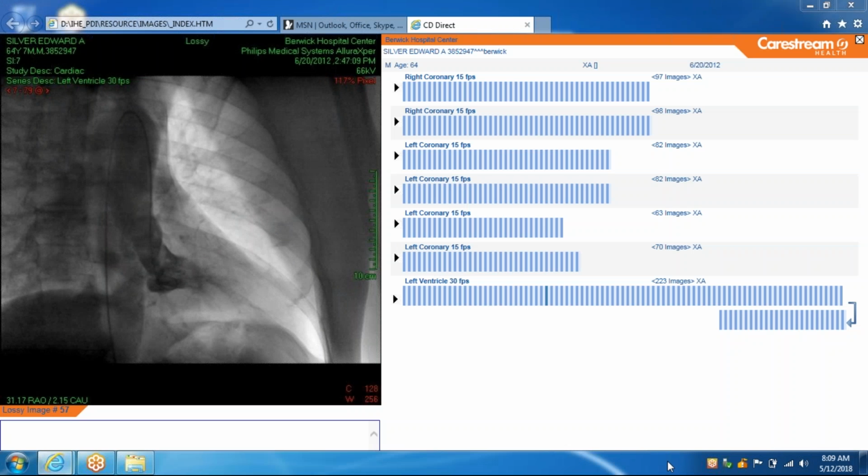All right. So when we do cardiac cath and cardiac intervention, we mentioned two accesses. You can do the femoral approach or the radial approach. It doesn't matter. There's a push now, or more people are going to the radial approach because it is less traumatic for the patient. You have less vascular problems.